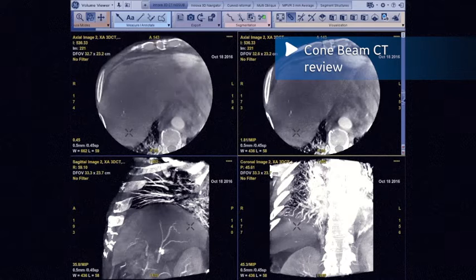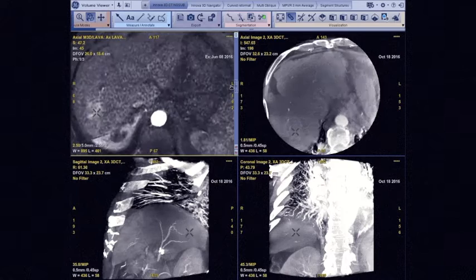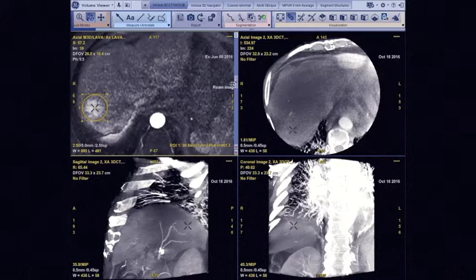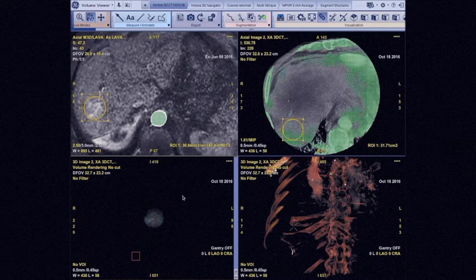We can see our acquisition performed in the room, reconstructed on the AW station. As the tumor was slightly raised in the arterial phase, we are going to synchronize it with the pre-therapeutic MRI to confirm its location. Synchronization is based on the vessels to maintain a good readjustment at the level of the tumor. We then segment the tumor on the MRI by placing a sphere at the level of the tumor, and ask the software to automatically replicate this sphere on the pre-therapeutic cone beam CT exam.